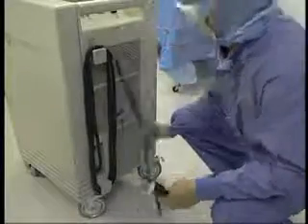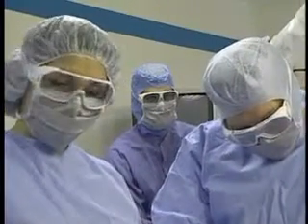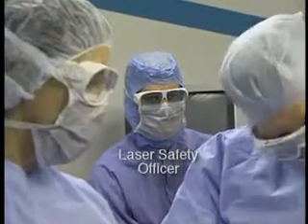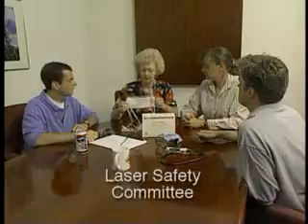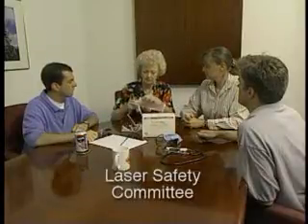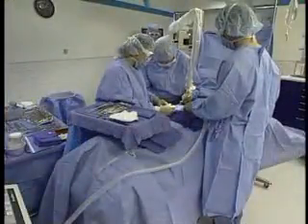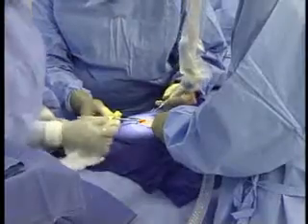Laser technology has opened new doors to less invasive surgery and has enabled surgeons access to pathology not before reached. The perioperative nurse manages patient and personnel safety during the application of this important surgical technology by observing recommended practices, applying laser safety knowledge, and maintaining vigilance during each patient application of laser energy.